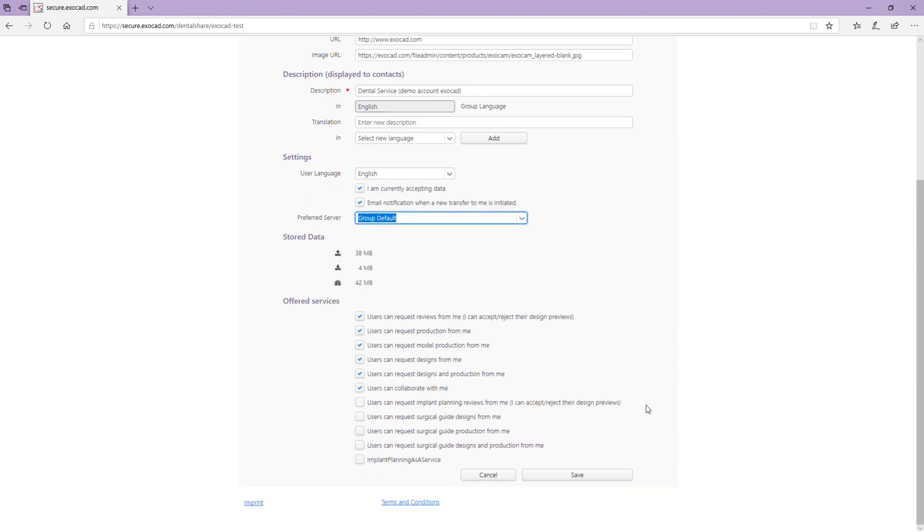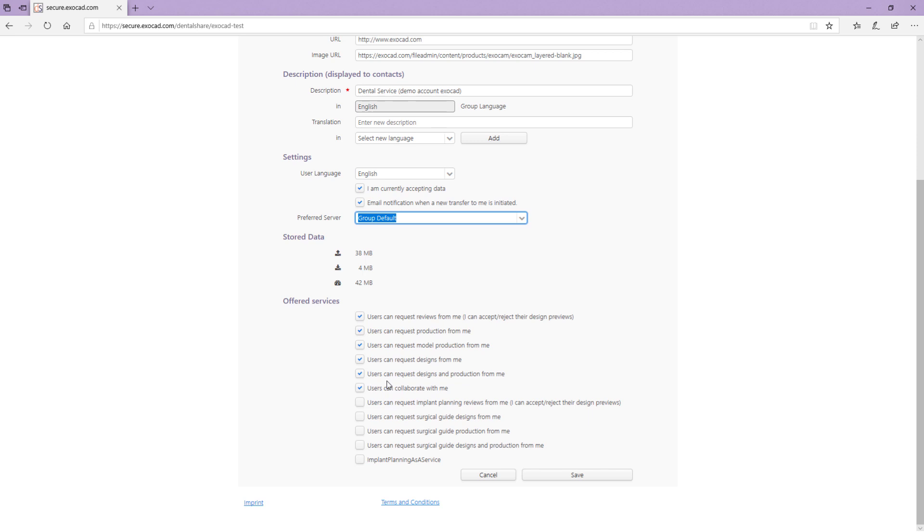Stored data displays the volume of data you have uploaded or downloaded and the total volume of data transferred for your account. Using the checkboxes, you can define which services you offer. Your contacts will only see your profile in their list when selecting one of the services you offer.